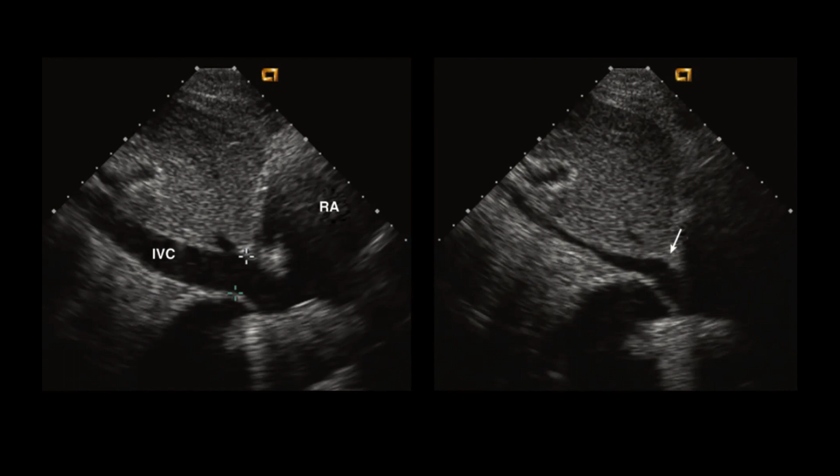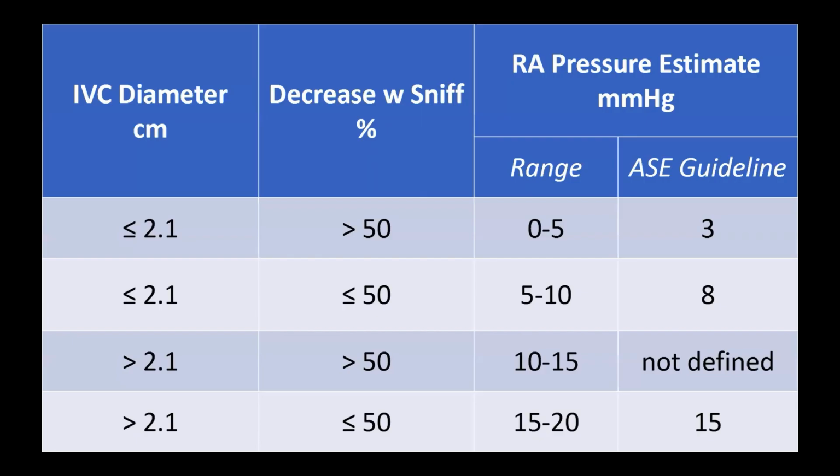So I'll go over the two ways to do this, with a sniff or with tidal respiration, when we go over the table near the end of the talk.